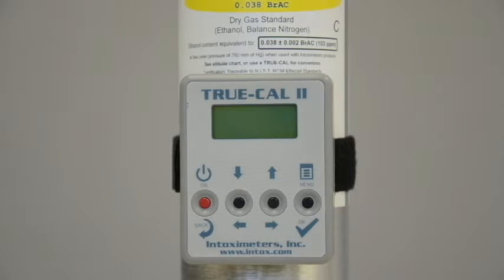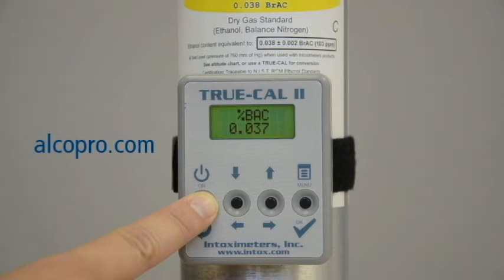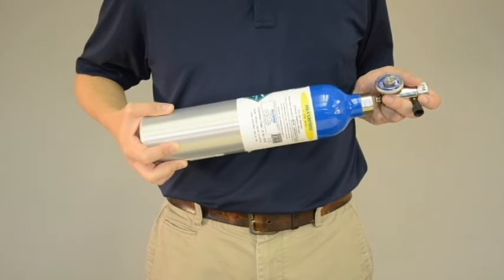You can also derive the expected value by using a TruCal device, which uses atmospheric pressure to predict the expected value of the gas. You can purchase a TruCal device at alcopro.com. Now that you know your expected gas value, you can proceed with the accuracy check.